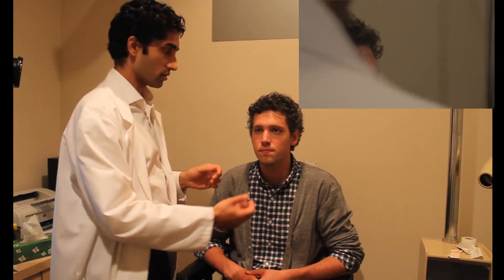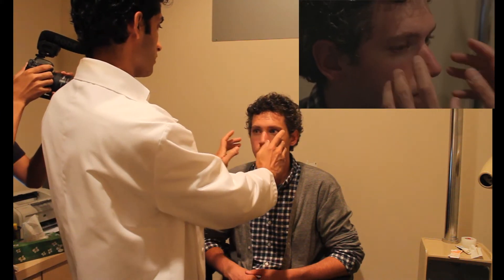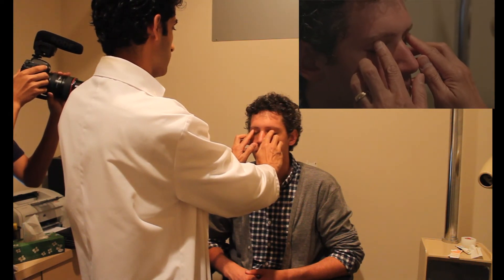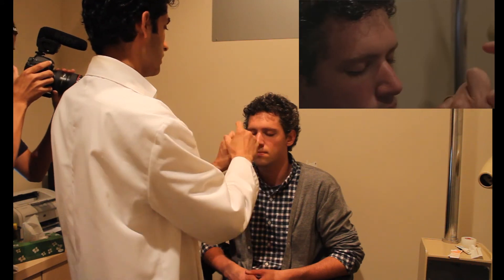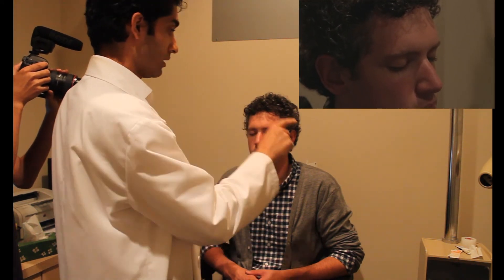An easy way to assess very high or very low pressures is to use your fingers. Using two index fingers, have the patient close their eyes and gently ballotte back and forth over the closed eyelid. If the patient has a very high eye pressure, it will feel firm — like your knuckle. If they have a very low eye pressure, there will be very little resistance. Comparing both eyes this way allows you to detect significant asymmetry.